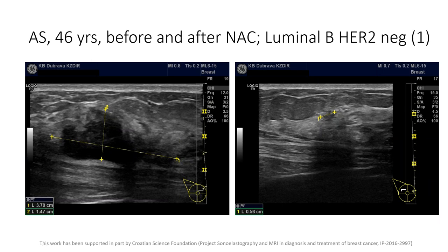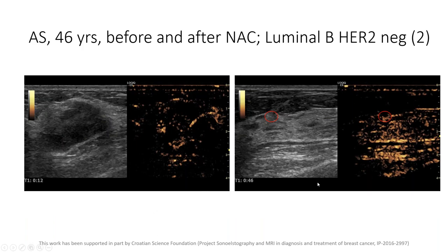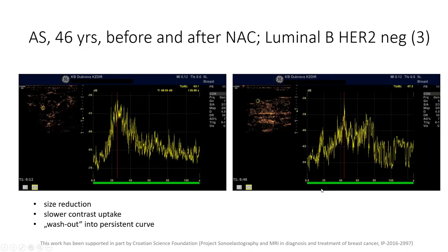Here are examples from our study. A 46-year-old female patient before and after neoadjuvant chemotherapy: B-mode ultrasound shows significant reduction in lesion size, while contrast-enhanced ultrasound shows a delay in enhancement after neoadjuvant chemotherapy. Analysis of the time-intensity curve reveals a change in curve type. We observe size reduction, slower contrast uptake, and a change from washout to persistent type — indicating a good response to neoadjuvant chemotherapy.